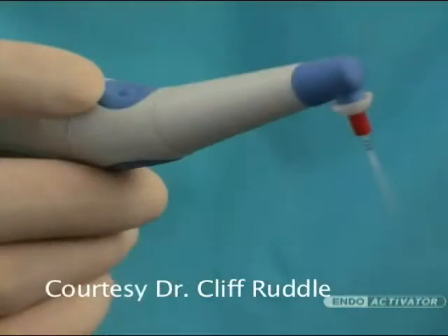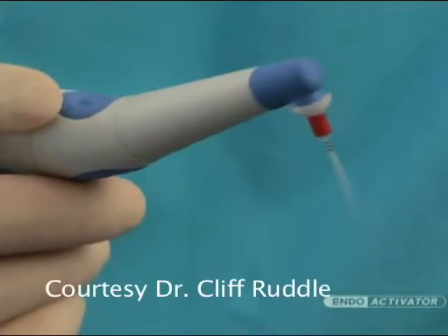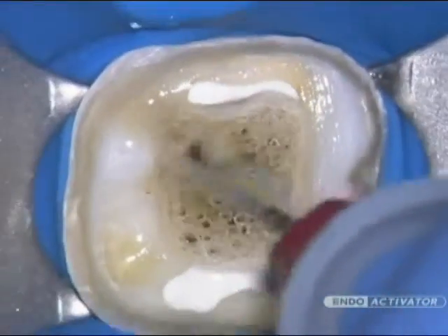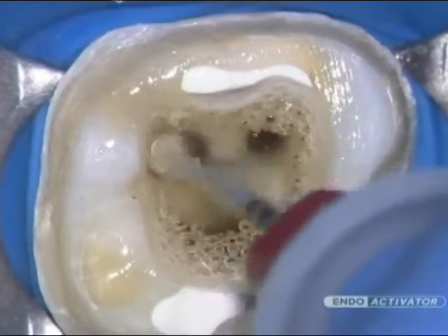The EndoActivator system uses strong and highly flexible polymer tips to safely activate various intracanal reagents and vigorously produce the hydrodynamic phenomenon. This new technology provides an advantage over traditional methods and offers a safer, better, and faster way to achieve success in the following clinical applications.